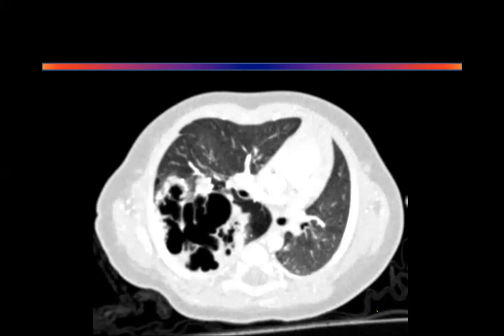Any differential diagnosis? Is there peripheral enhancement in this? Yes, I agree with you. There is evidence of peripheral enhancement because the lung has collapsed and consolidated in that area. It is collapsing and consolidating the normal lung. I agree with you, there is peripheral enhancement. Excellent. What do you think this is? Give me a few diagnoses. Most likely a multilobulated abscess. It can be emphysema, with bullous lung disease.